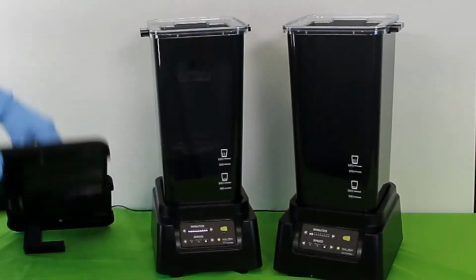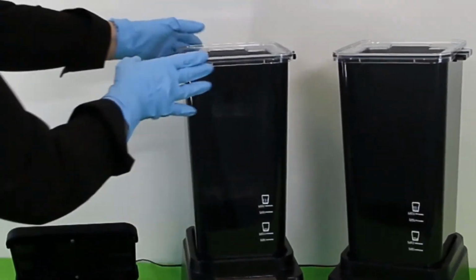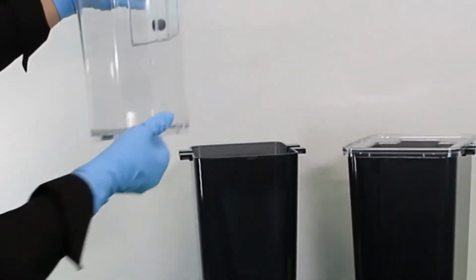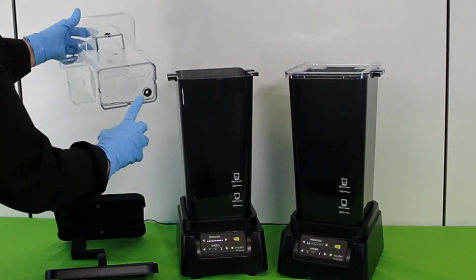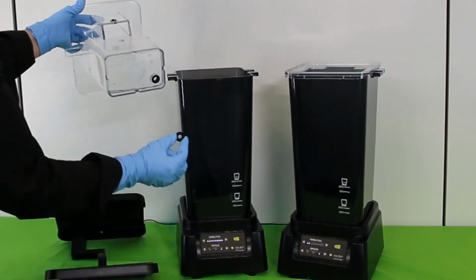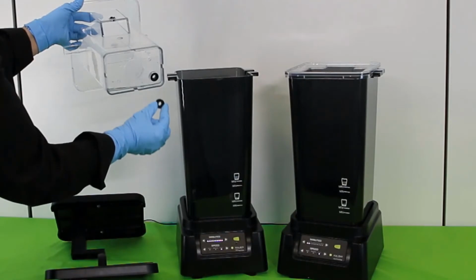For proper use, the overflow container plug and the gasket in the inner container must be checked. Make sure that a gasket is inserted at the bottom of the inner container. The delivery includes 2 replacement rings.